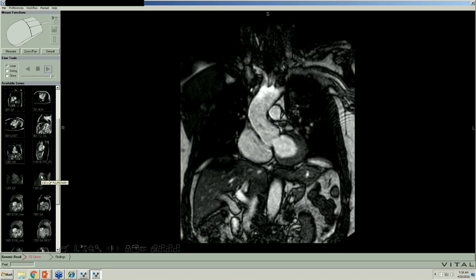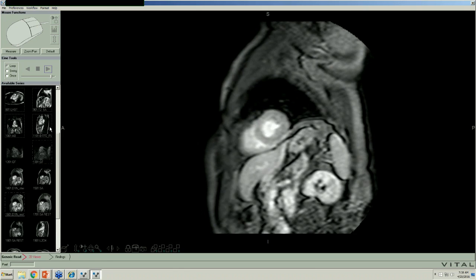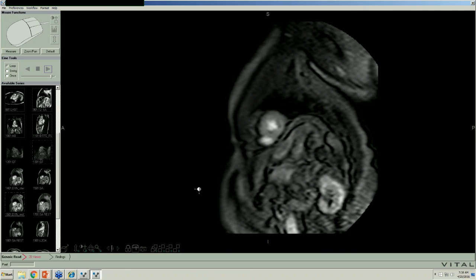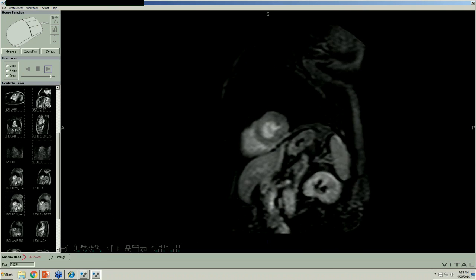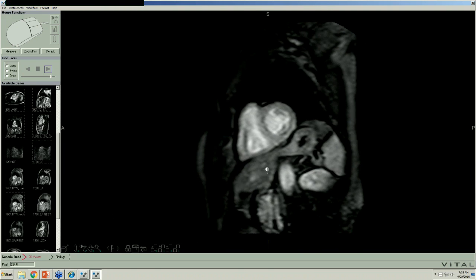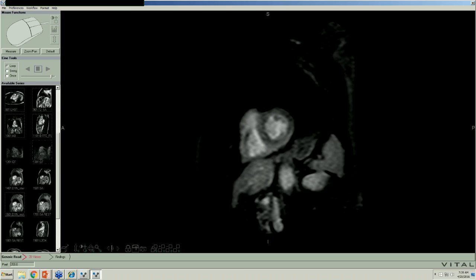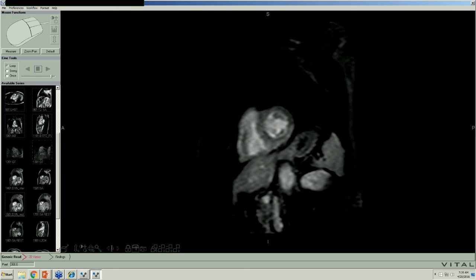But let's put some contrast in there and see what it looks like. Well, this is not contrast. This is phase. Phase is the same thing you do when you do a Doppler. This is contrast, so let's see what happens with this one. When you put contrast in, you really like to sort of dim things down a little bit because it gets pretty bright. And so you want to see the effect. And the contrast comes in initially. There are areas that aren't filling with contrast in several places, initially there's a black zone in various places around here. Black here, black over there, black over there. And so that's not quite right.